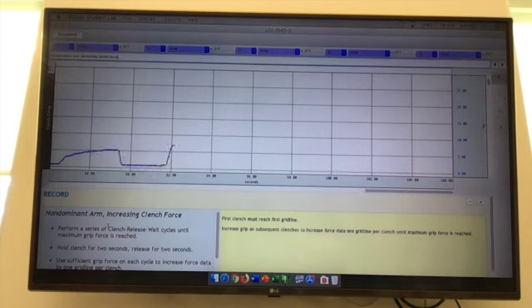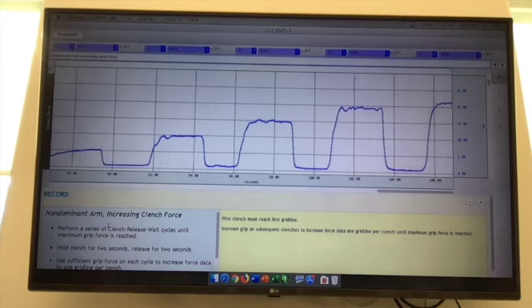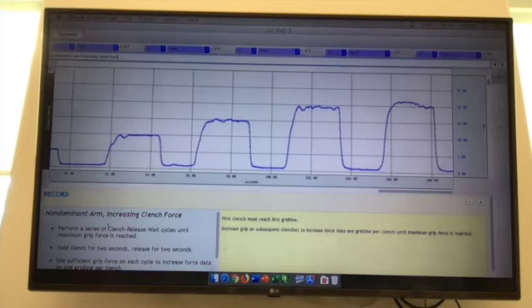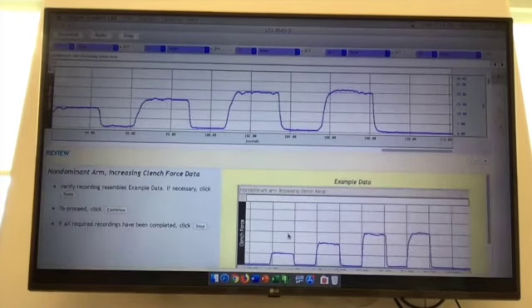And you might anticipate that for your non-dominant hand, we probably won't have as much grip strength because you just don't use that hand as often. And so you probably don't have as much muscle in your non-dominant hand, but we'll see. Okay, so that was their maximum. Again, we see the stair-step pattern with their data, so we can go ahead and click continue.